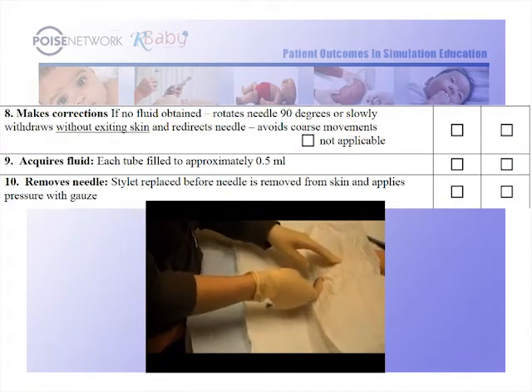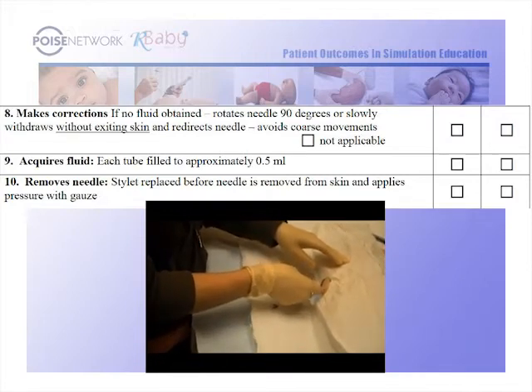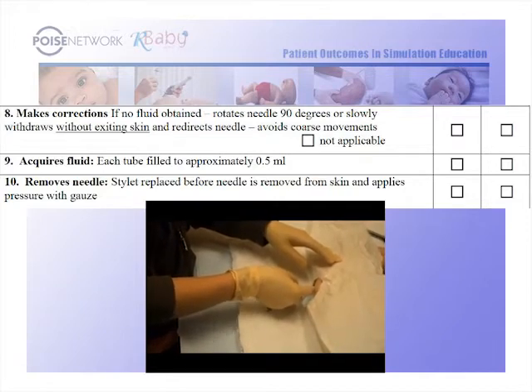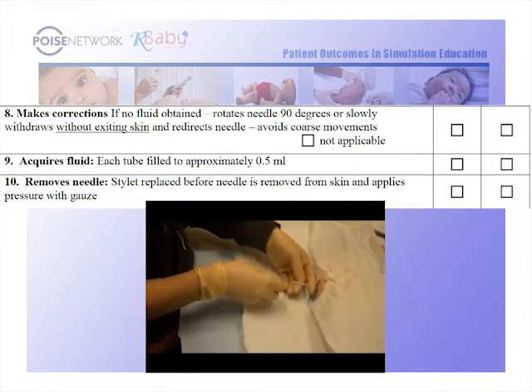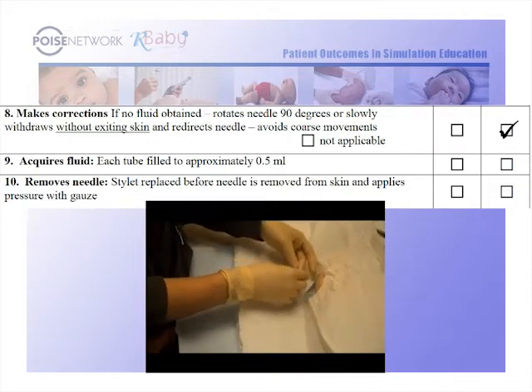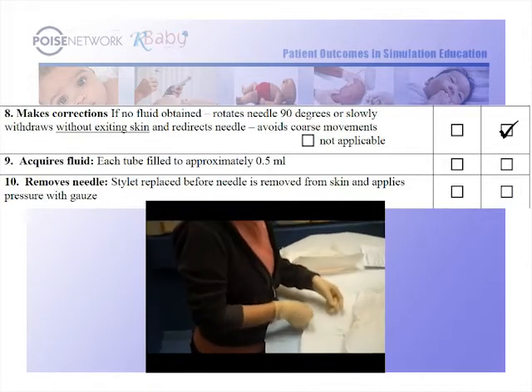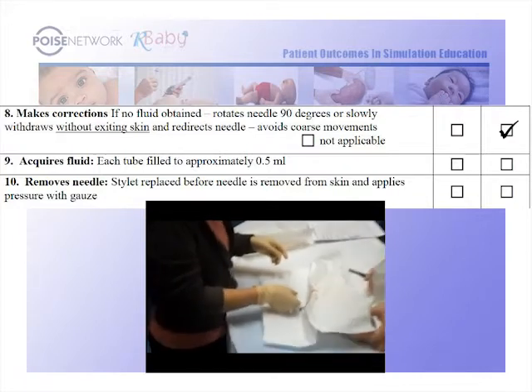Okay. You can try to, remember, point towards the head a little bit, 45 degrees, and advance it slightly. There you go. What are you feeling? Are you feeling any bony resistance or anything like that? No, I don't know. Okay, why don't you check? I'm not going to poke anything in there. I don't have anything.